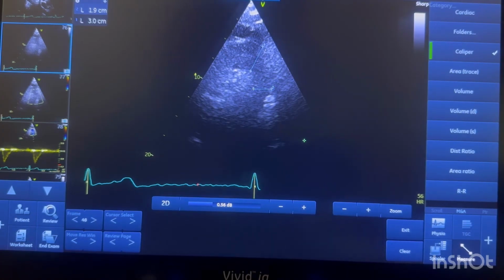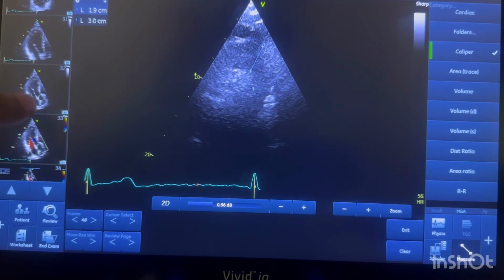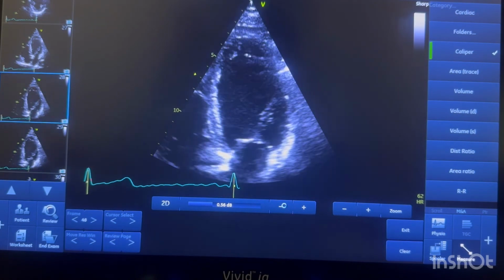So these are the main measurements of a normal echocardiogram. There are some measurements which we need to do for, for example, MR and AF, and I will show you those when we do those cases. One thing I left before: I told you that I will tell you about the LV volumes later on. So let me do the LV volumes for you, and I will also explain the tricks about the LV volumes. So let's go into this one.